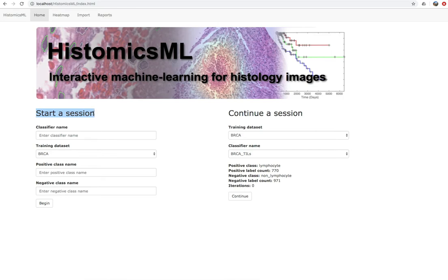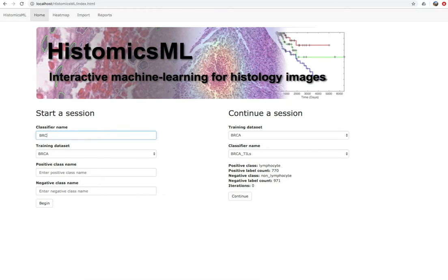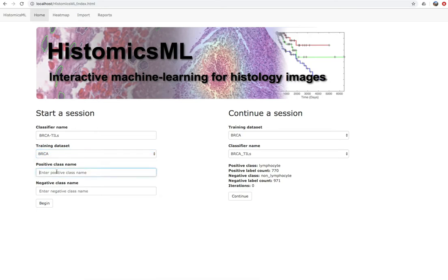On the landing page there are options for starting a new session or for continuing a previously established session. To start a new session, enter the classifier name, select the training data set to use, and enter names for the positive and negative classes. In these examples, we will be classifying tumor infiltrating lymphocytes, or TILs, and so we will label the positive class TIL and the negative class as non-TIL, representing all other classes. After entering this information, click Begin to start the session.